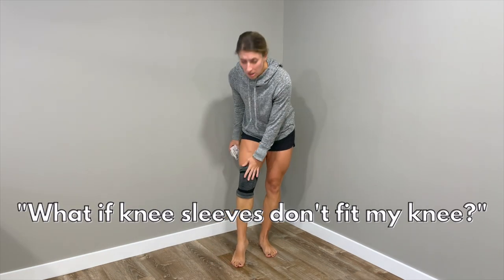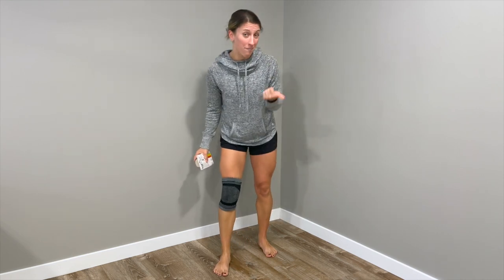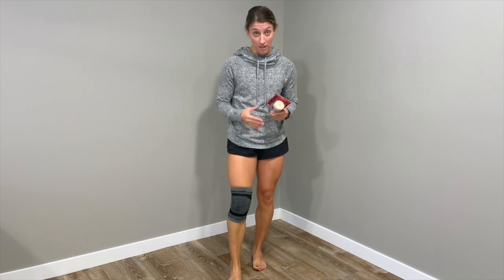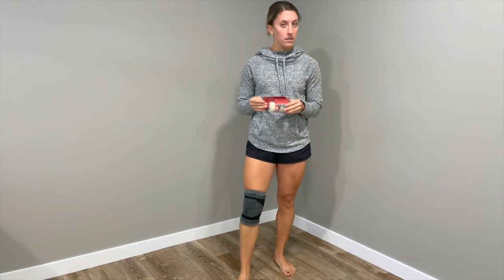Sometimes compression sleeves can be hard to find one that fits, and it can be a little annoying if it keeps rolling. So here's another option: if you're having difficulty finding a sleeve that fits your knee, you can use an ace wrap bandage to essentially give you the same effect of compression.